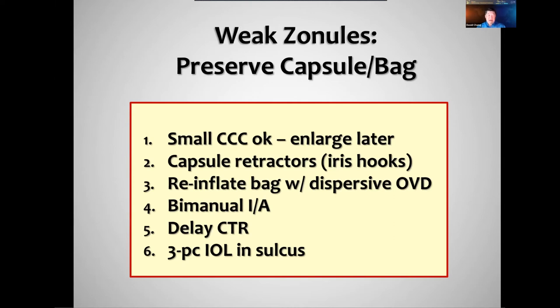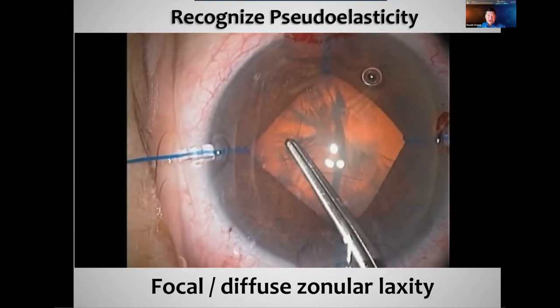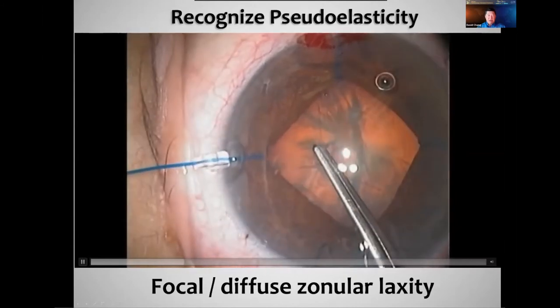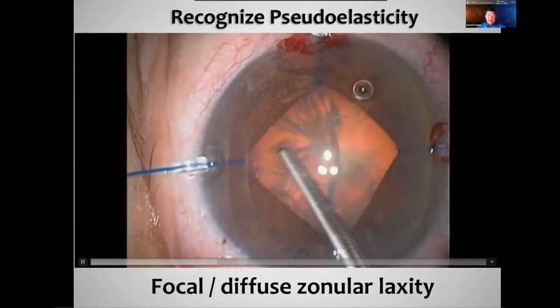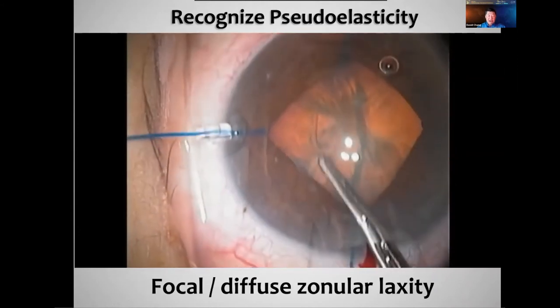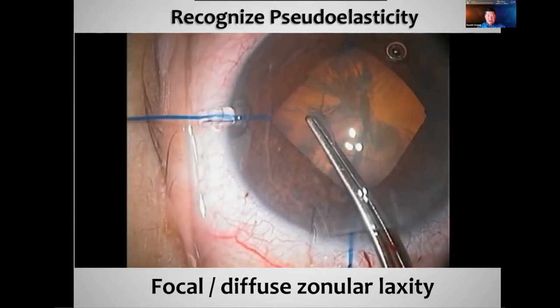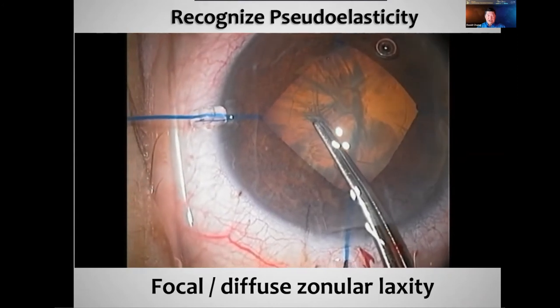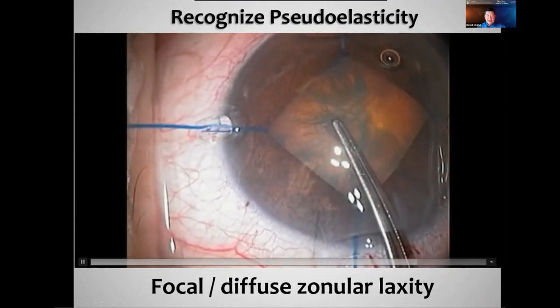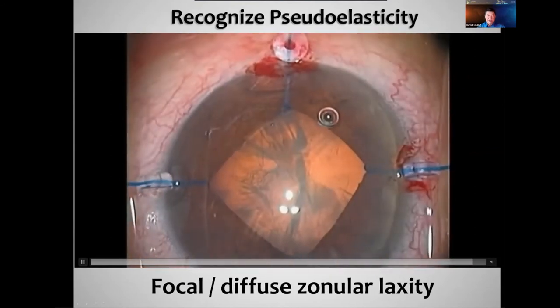Remember to reinflate the bag when dealing with the last piece or even with the cortex using a dispersive viscoelastic. Think about bimanual I&A, which helps you better control the position of the port so you don't aspirate the capsule. Wait to put the CTR in — hopefully until after the cortex is removed so you don't trap it. Now this is pseudo-exfoliation — look at the peripheral capsule. When I'm trying to pull the flap, the whole peripheral capsule moves. That's abnormal — it's as though it's elastic, but what's really happening is we don't have zonular tension anchoring it, and that's what makes it hard to control.